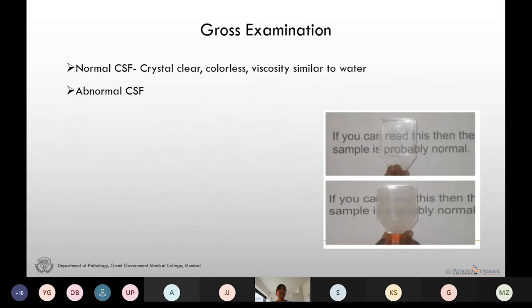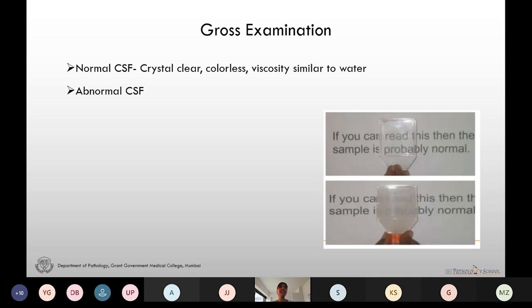First we examine the CSF grossly. Normal CSF is crystal clear, colorless, and its viscosity is similar to that of water. Abnormal CSF can be turbid or cloudy, viscous, pigmented, tinged, or clot formation might be present. To determine clarity, we hold the tube against written paper — if we can read through it, it is clear; if not, it is turbid or cloudy.